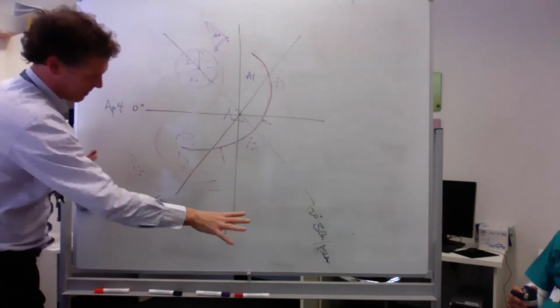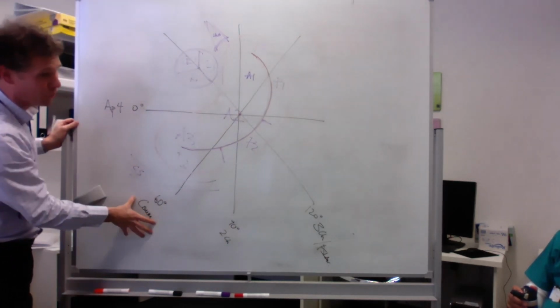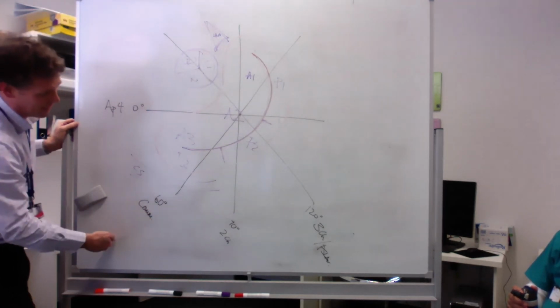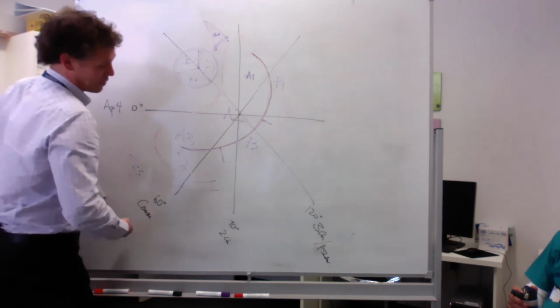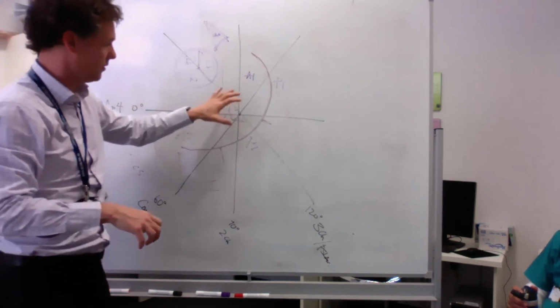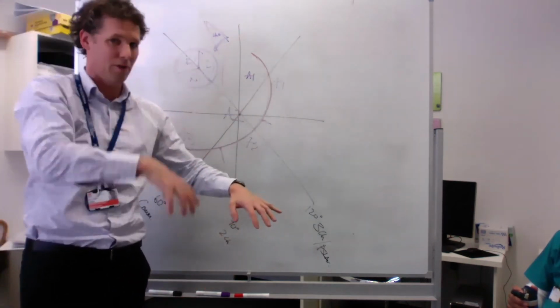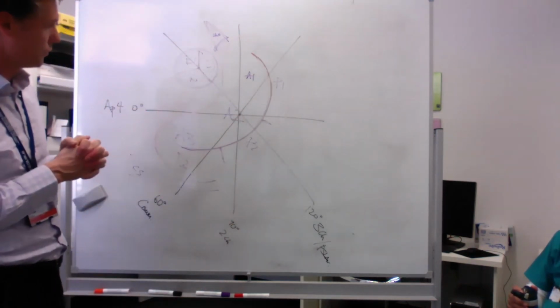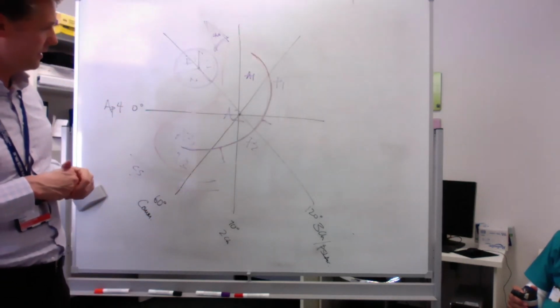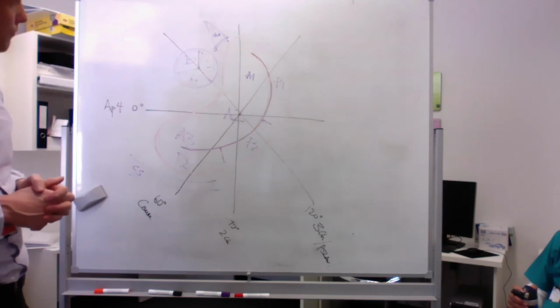So, if we stick to the commissural view, which is a classic one that we talk about at about 60 degrees, that's the big one that they love showing in the exams, going through P3, A2, P1. And if you've got a scallop that's jumping up at the top, that's A2. There's only one view that you get that in, and it's not really a 2-chamber.